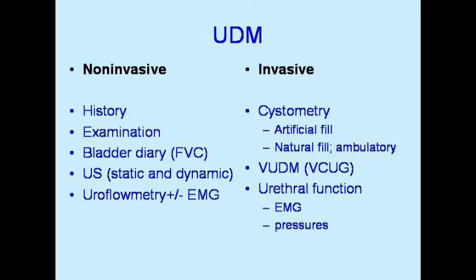The invasive component is the cystometry, which can be artificial fill or natural fill, with facility for screening and fluoroscopy, with EMG for urethral function, along with urethral pressures.